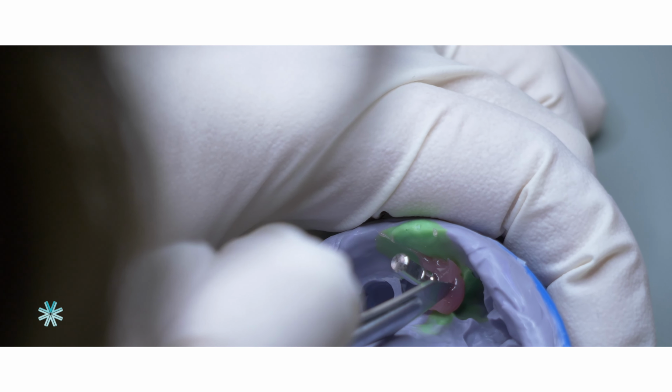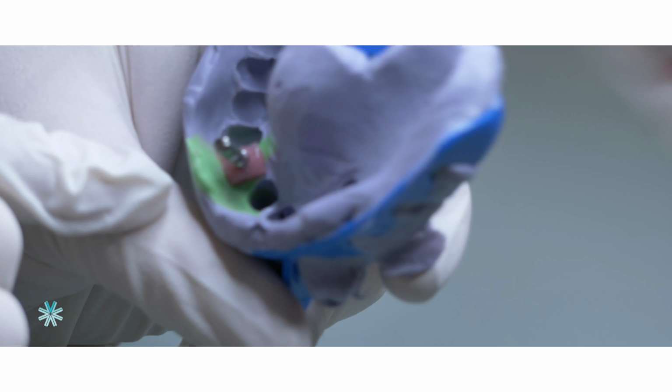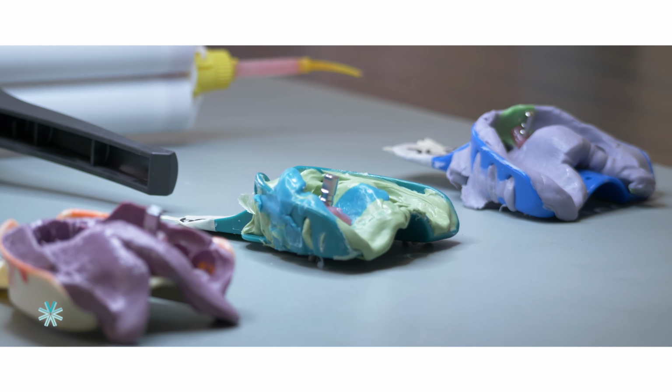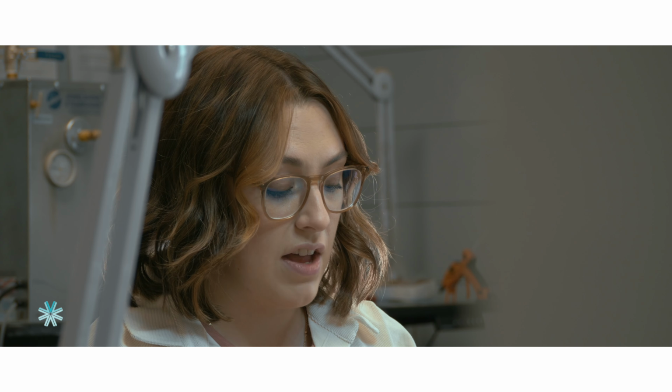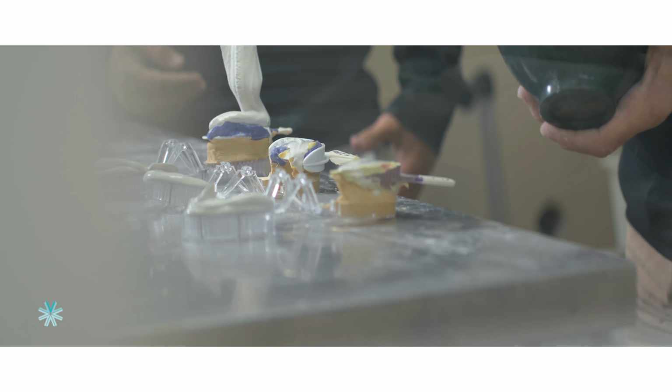Once the soft tissue is dry, we take our knife here and trim away any excess tissue that might have been overfilling into an adjacent tooth of the impression. That way we know that we are designing the impression to the proper contacts and stuff like that as well. The next step for these is to go on to the model department and they'll get poured up.